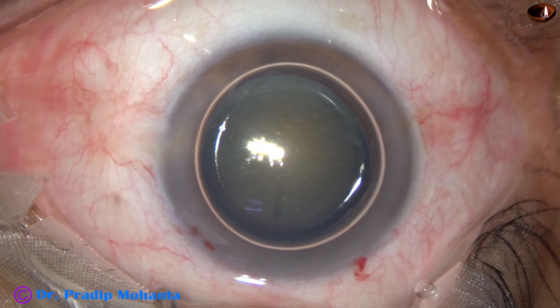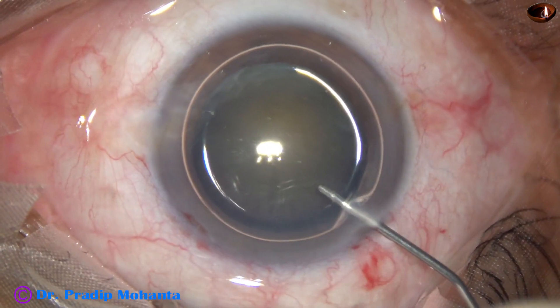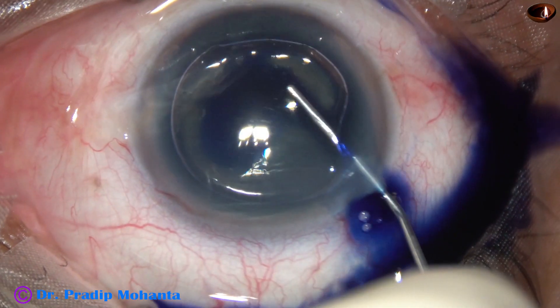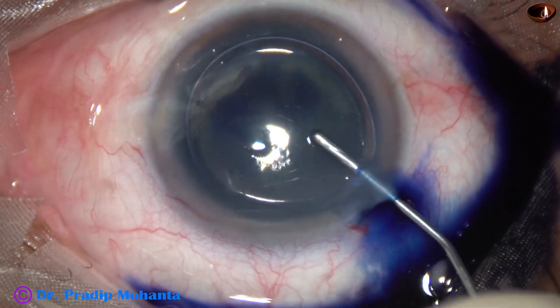Let us observe this surgery. By this time the incisions have been made and an air bubble has been injected. Now I am staining the anterior capsule with Trypan blue dye. This is a totally unedited recording of the surgery.